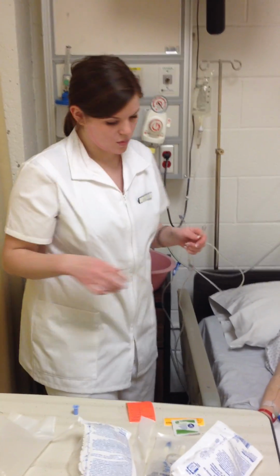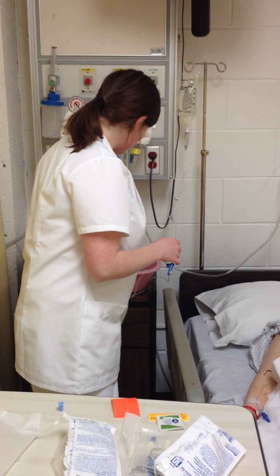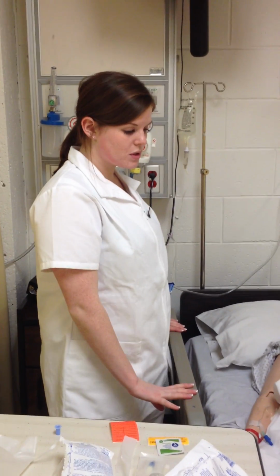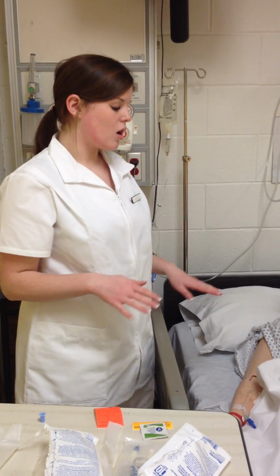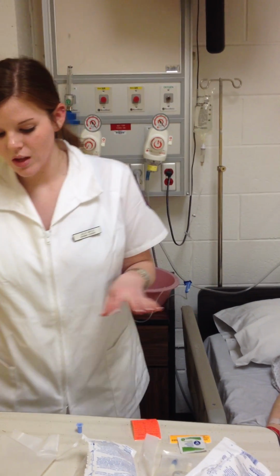When I am inserting the port, I will be wearing gloves for protection. And then I'm going to remove my gloves, wash my hands, and record on the I&O sheet. And then I'm going to lower the bed to the lowest position, make the patient comfortable, and put the call bell button in reach in case he or she needs me for anything.